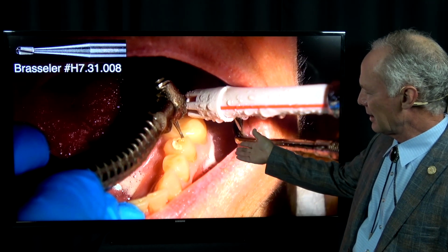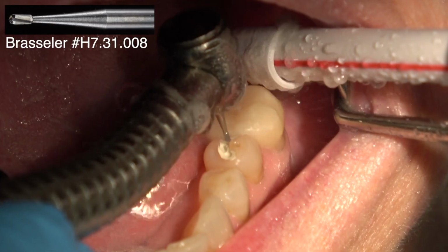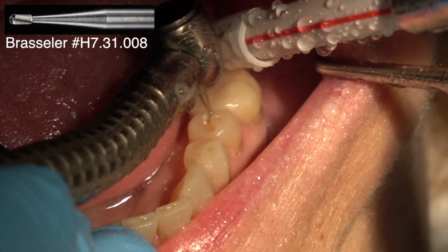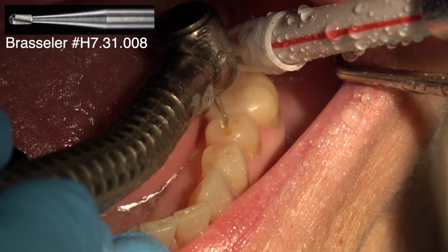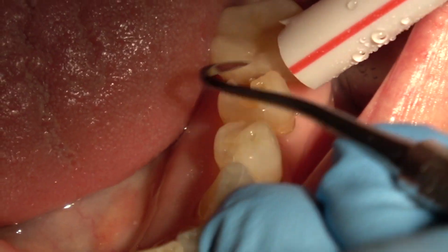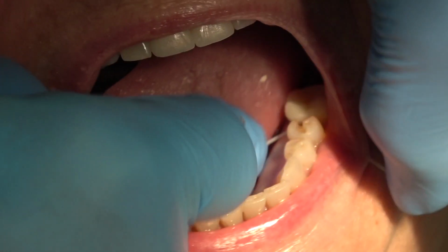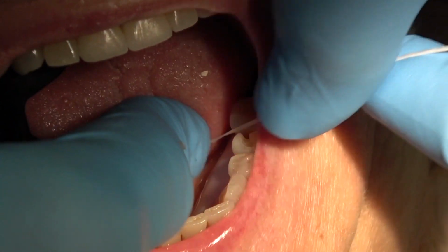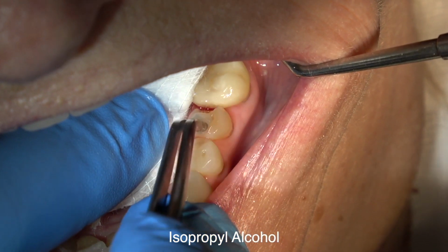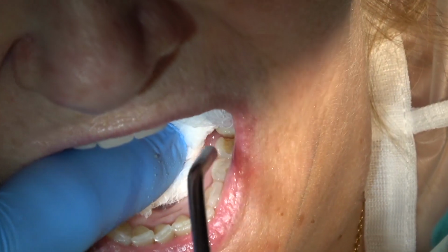So now I've anesthetized the teeth. The patient's returning for seating of the inlay, and after I've anesthetized, I'm just removing this provisional restoration with my 330 carbide burr. Just light touch, not touching the tooth, and then using a scaler to remove any little bits, and then we'll floss that. Then isolate the tooth and clean it with isopropyl alcohol on a small cotton ball. Rinse it off.